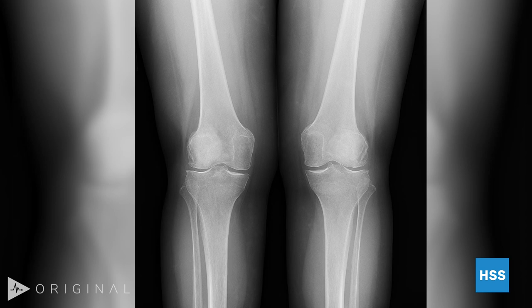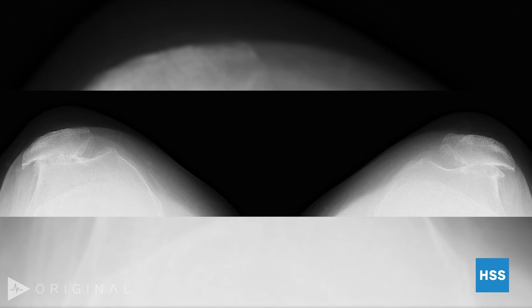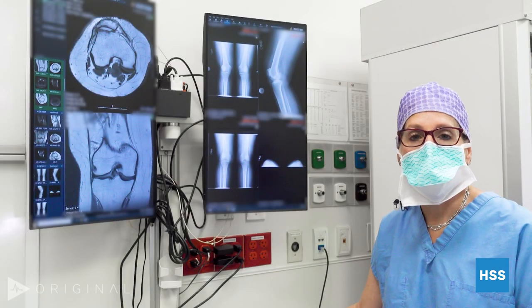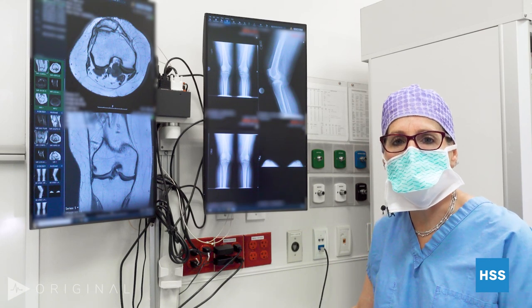Where we see this woman's problem correlates with her symptoms. On the lateral view, there's no space between the patella and the trochlea or femur. On the merchant view — which shows the patella in its track — on both sides she has complete bone-on-bone arthritis on the lateral side of the patellofemoral compartment. She has what's called malalignment arthritis. The kneecap has sat in a position where there's been much more weight on one side than the other.